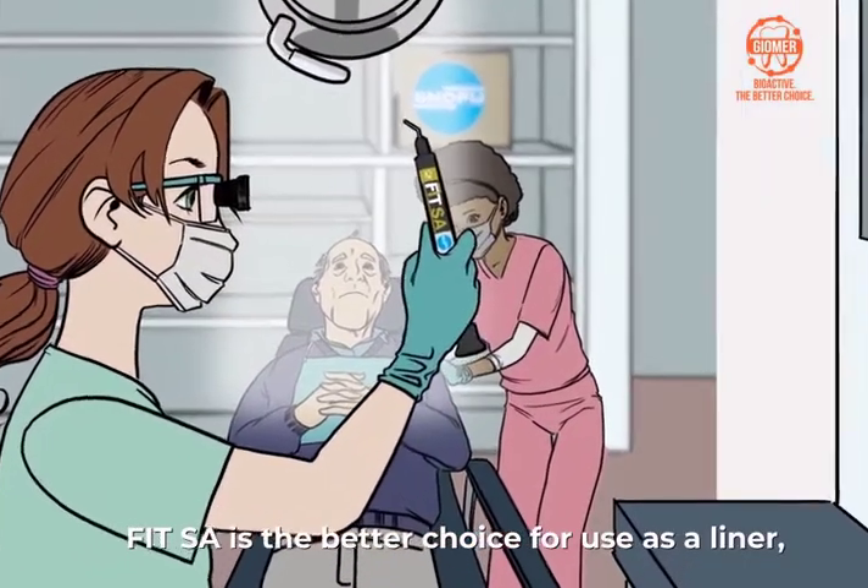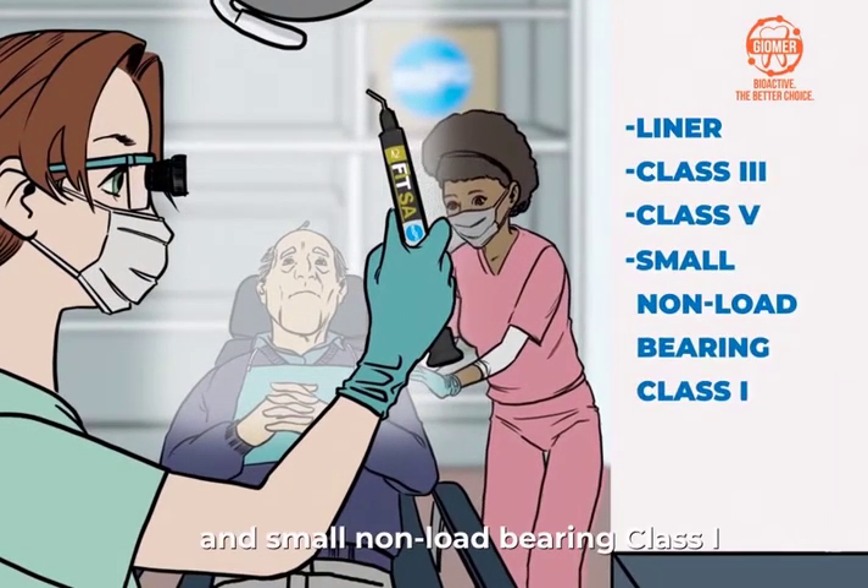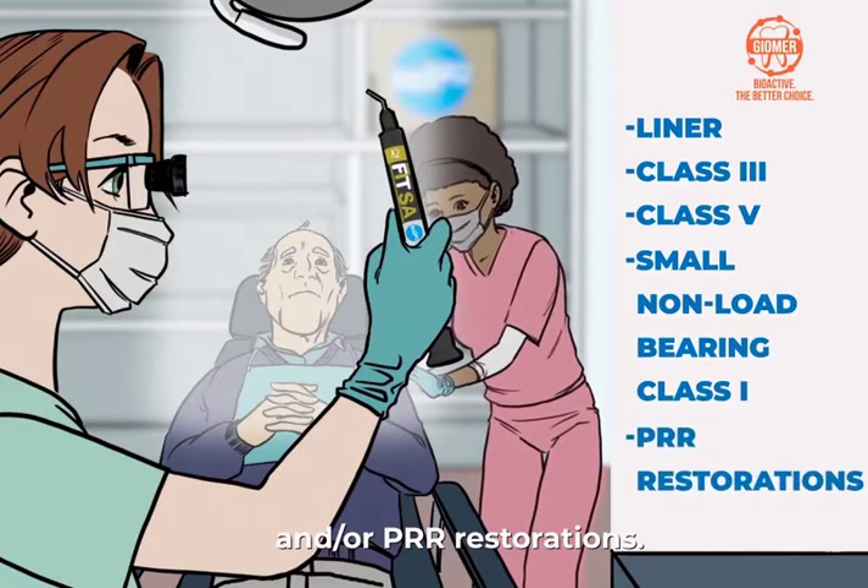FitSA is the better choice for use as a liner or class 3, class 5, and small non-load-bearing class 1 and/or PRR restoration.